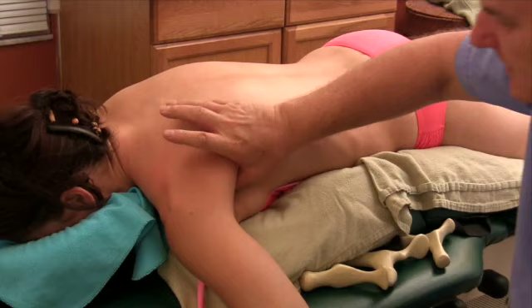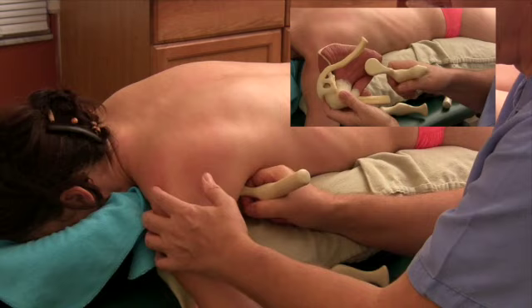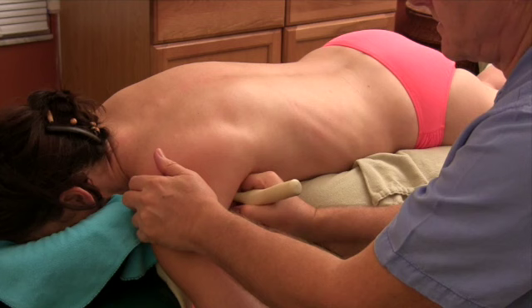I began to visualize early on in my career some sort of tool that would be able to reach into areas that I couldn't get into, or that was very difficult on my thumb — for example, subscapularis. I used to think somebody should invent something that would help reach up underneath there so it didn't kill my thumb so much. Twenty years later, I decided if someone's going to invent them, it's going to have to be me.